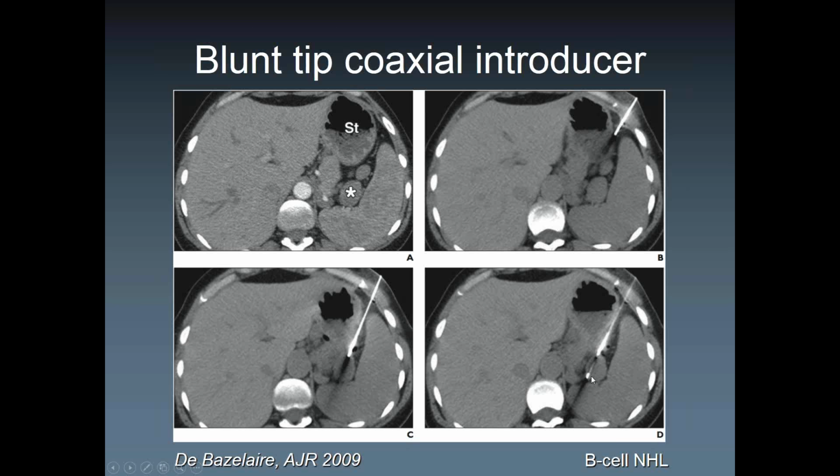Another big no-go is to go straight through a potentially malignant target if it's not surrounded by host tissue. At least not in the peritoneum. That's different for the retroperitoneum. Retroperitoneum is not a cavity. Everything is going to be contained. So if you cause seeding, let's say around a perinephric mass, the cells are going to stay in place, and you can still ablate them later on in second stage, for example.